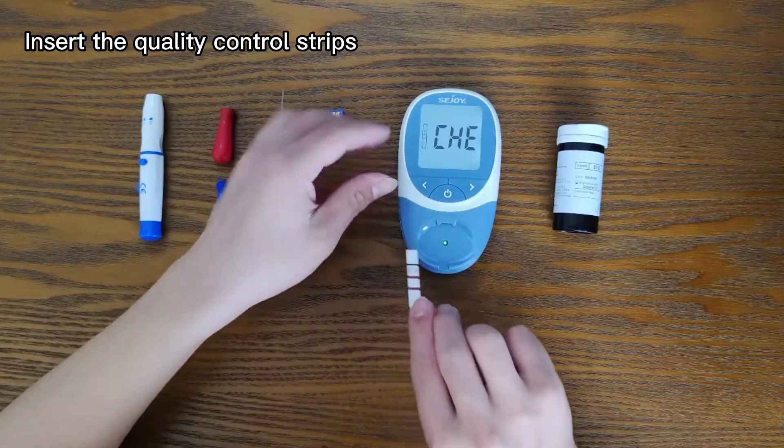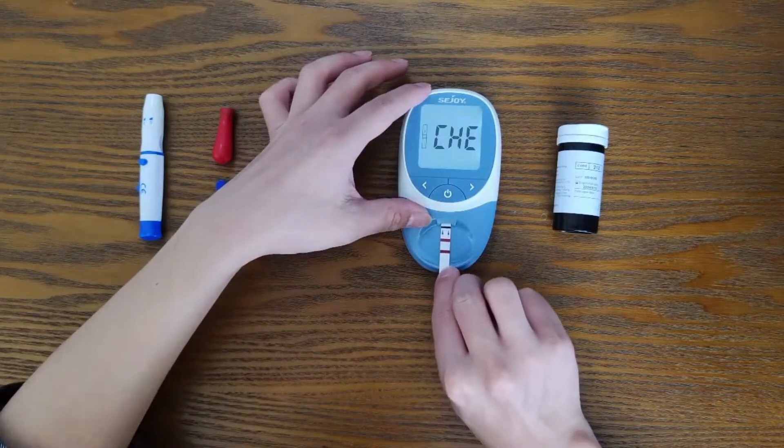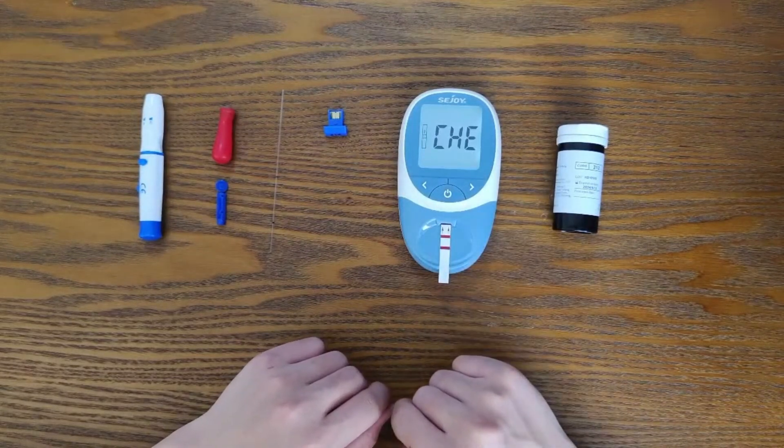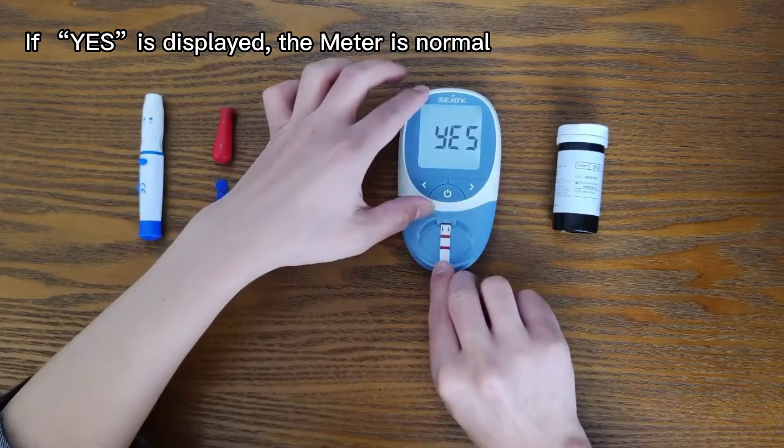Insert the quality control strip. Press the boot button to start optical system inspection. If 'yes' is displayed, the meter is normal.